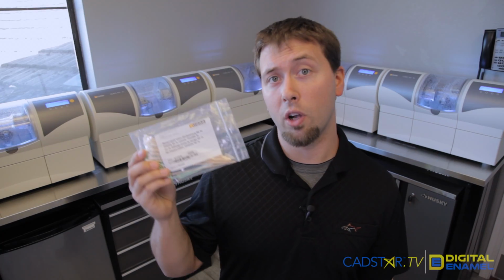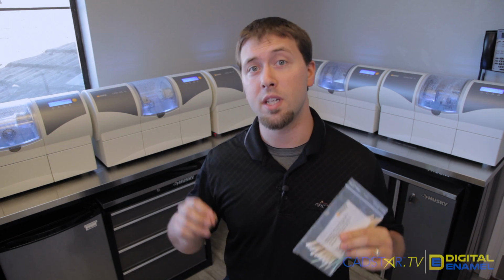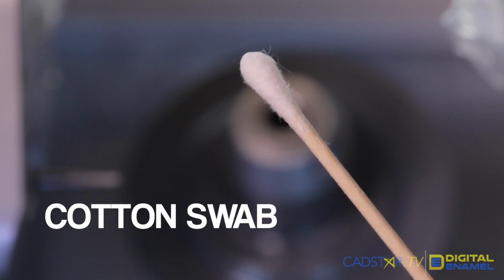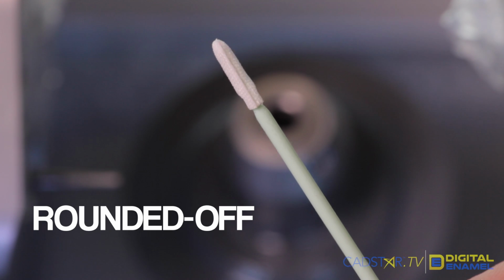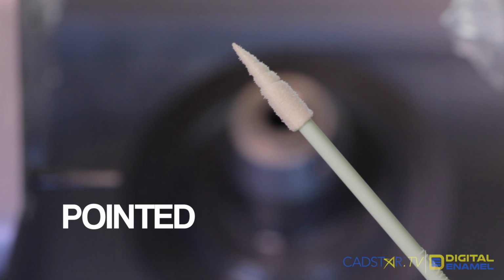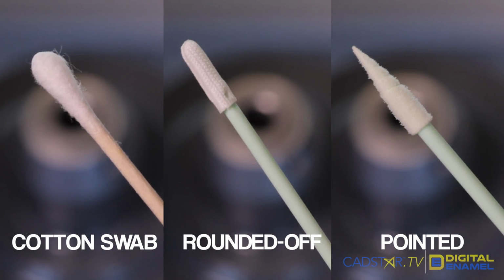You're going to want to order a cleaning set. With this cleaning set, you can see it comes with a few specialty cotton swabs. It comes with the regular cotton swab, a normal cotton tip applicator, a rounded off cotton swab, and also a pointed cotton swab. And you notice the grooves in there that help push out dirt. So these three are the main tools that we'll be using.